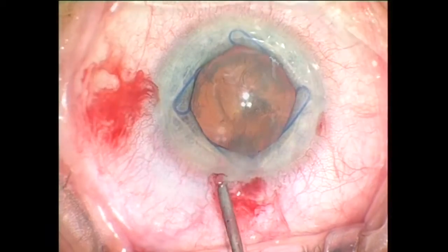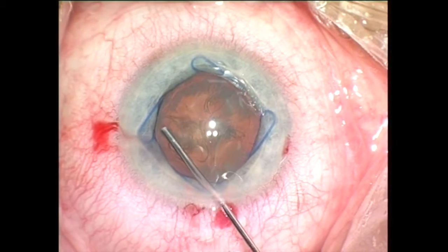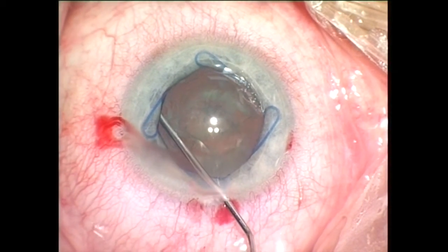The second version of the Malugin ring creates a perfectly round pupil which is slightly over 6 mm.